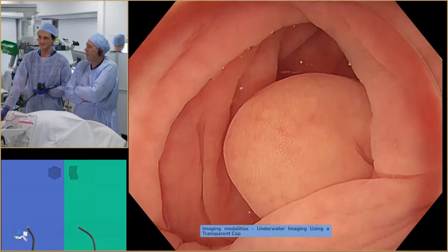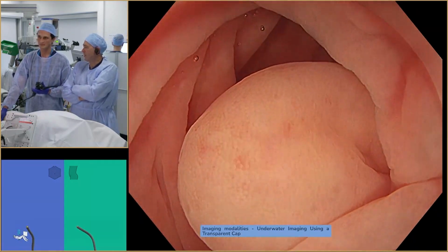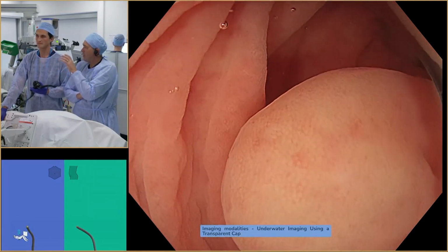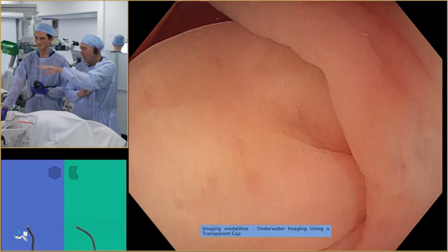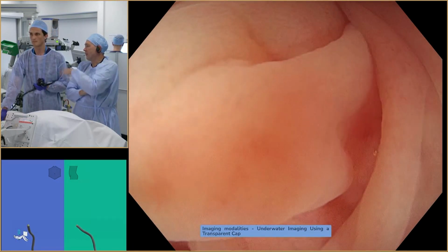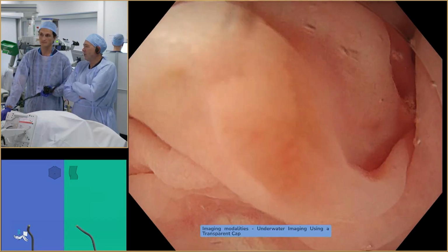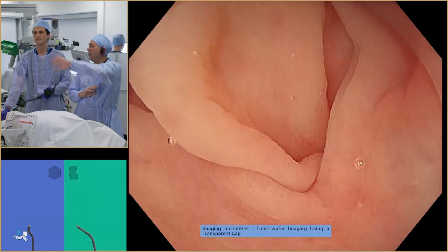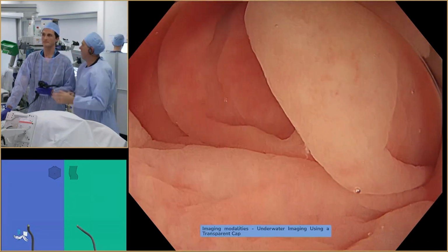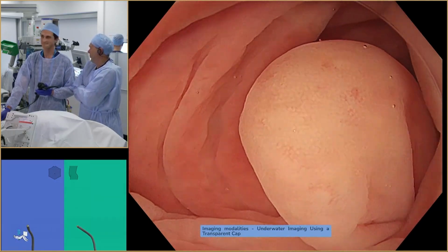So the other thing to think about when we're looking at something that we think is a polyp is, one of the critical steps is, where does the polyp join the normal mucosa? Where's the border with the normal mucosa? If you look at the base here, is it in continuum, or is there a clear margin of one joining another? It's in full continuum. So we have a lesion here which has completely normal mucosa above it. In isolation, if it was a bit yellow, you might say, well, that's a lipoma. Are you going to get 3 lipomas together in the same segment? It's very unusual. It's possible, but not.